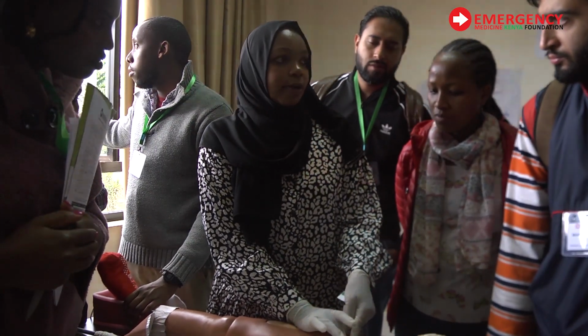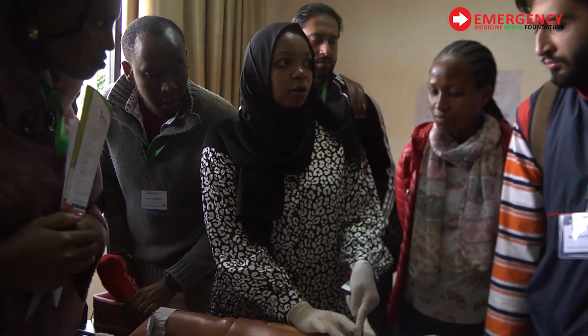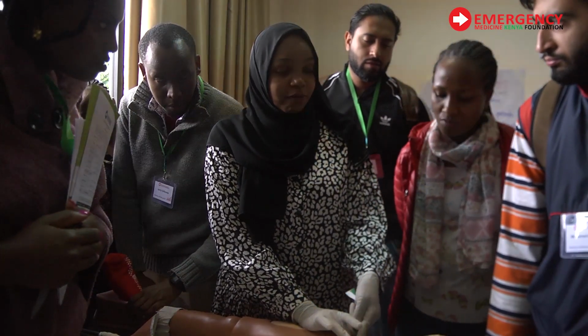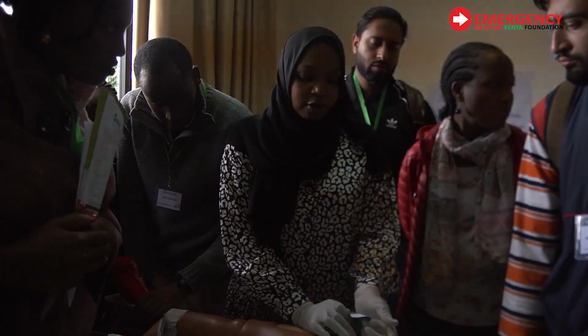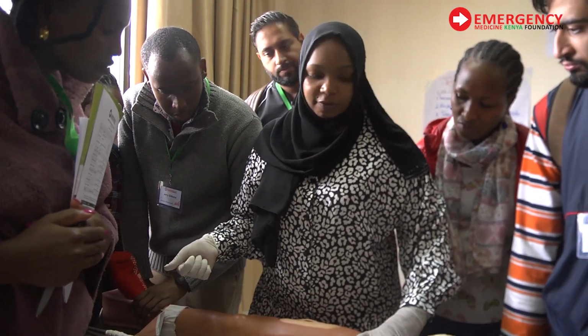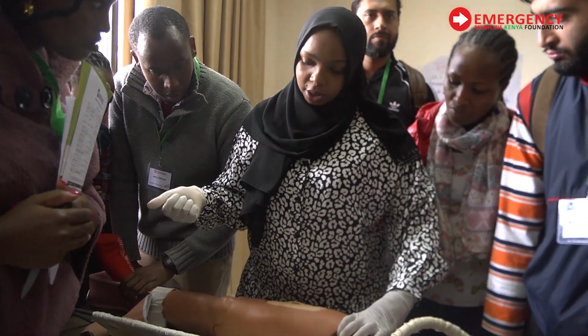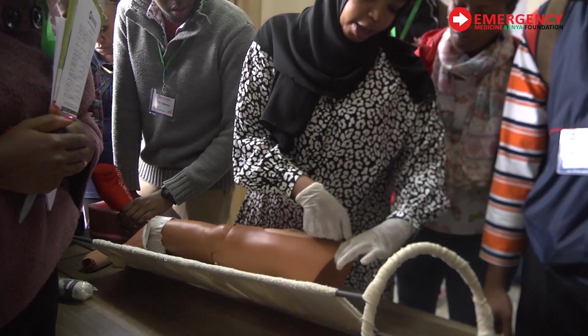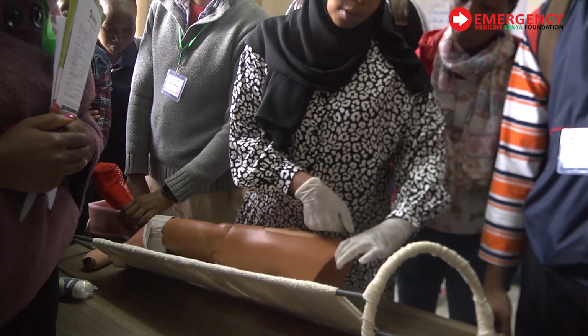Never leave your hand there. Make sure your hand is at the artery, it's actually pulsating on you. Then you take your syringe. Most of the time I do this: I have my artery, I have my syringe, I take my 20 cc needle, I take my lignocaine. I'm sure I'm there. I pull back to be sure there's no blood.